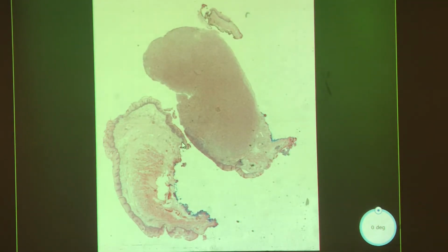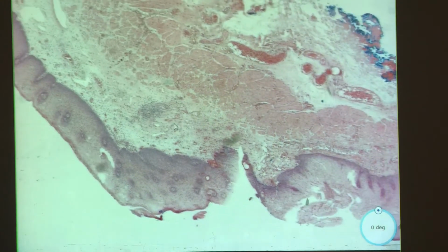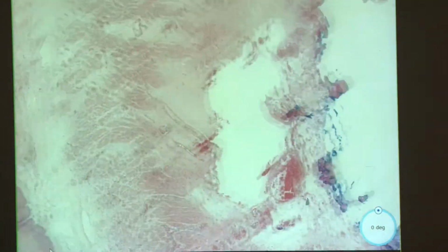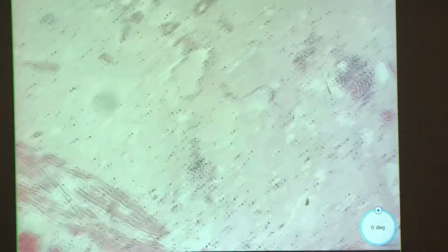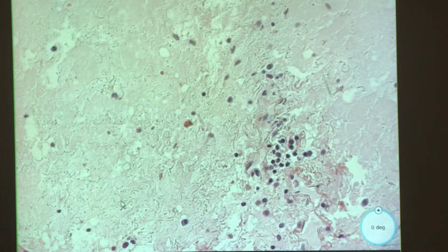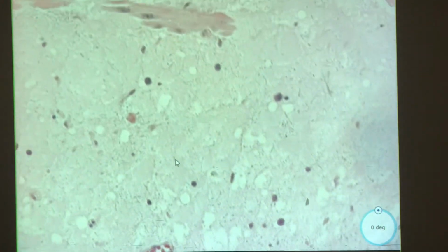So another biopsy, some sort of mucosa at low power. Something funny here, maybe. Let's just go in. Okay. So this piece, squamous mucosa, some muscle, nicely inked, deep margin. It's kind of edematous, like what is going on here? We'll come back to it. Let's go over to this area that looks more exciting.